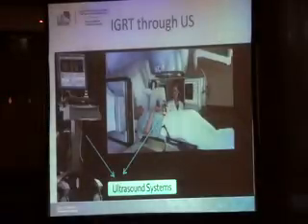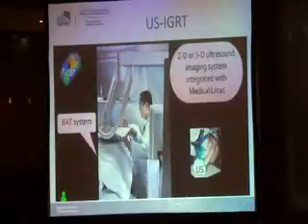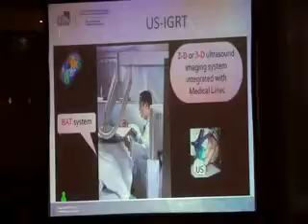You can use the ultrasound to verify the position of the prostate, and with this ultrasound, there is a lot of work done, and there are many machines in the market that can give you the exact position, and within this exact position there is a threshold.